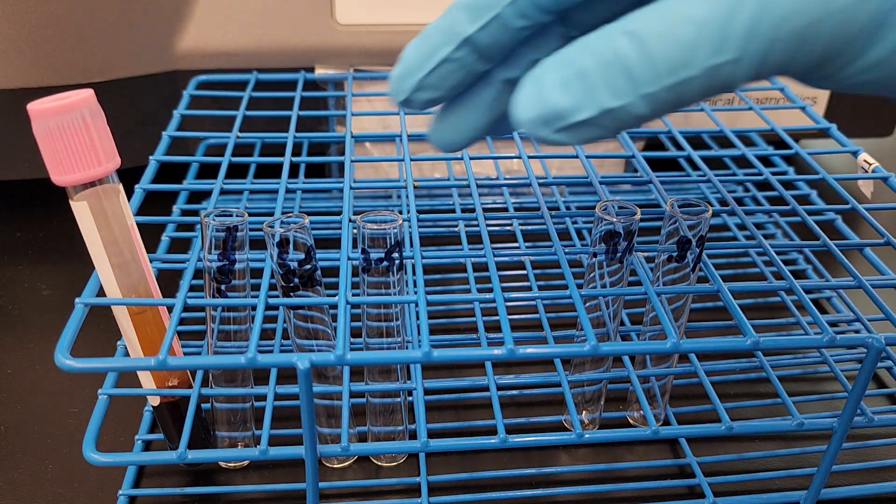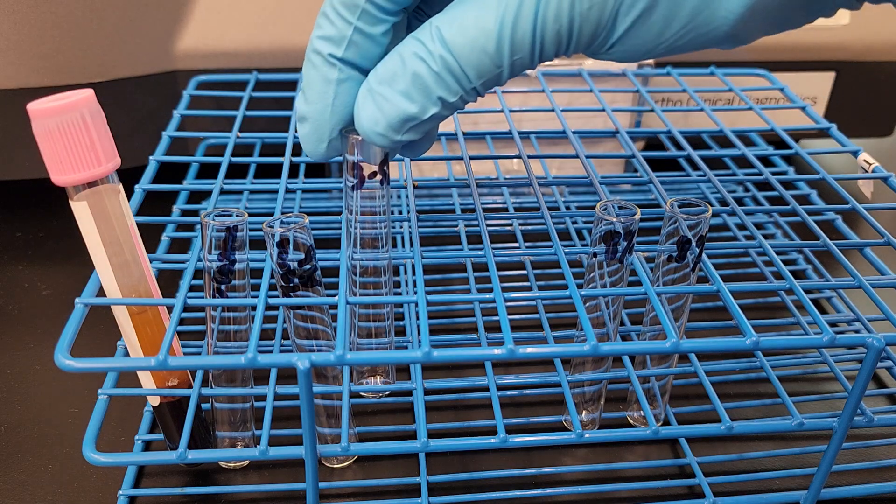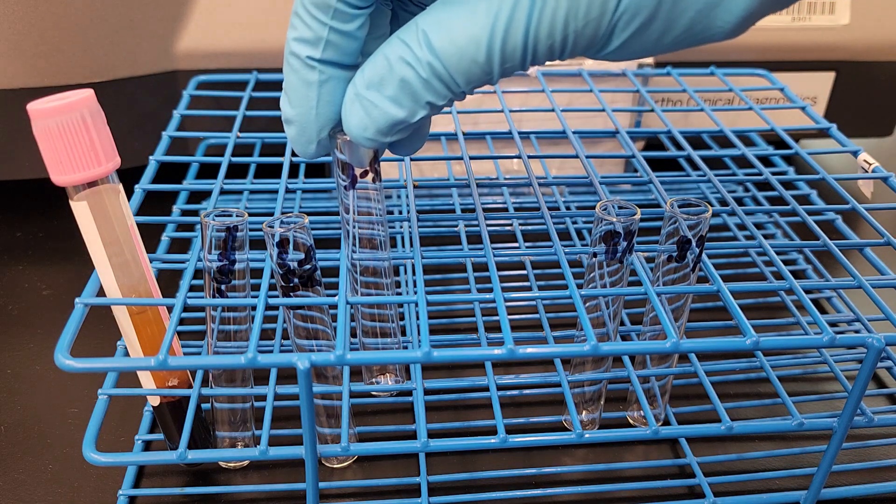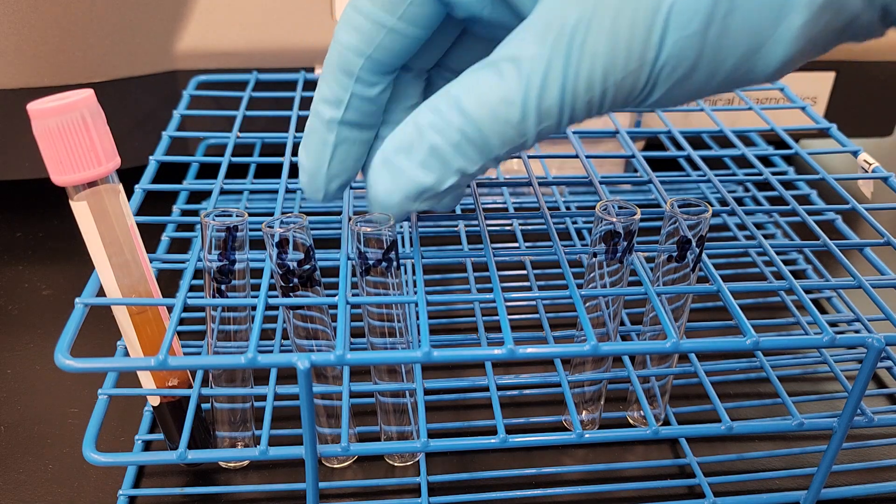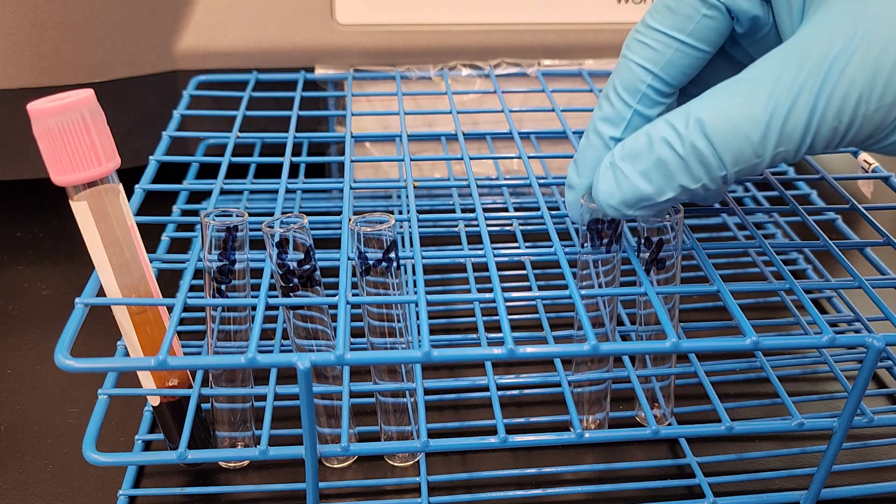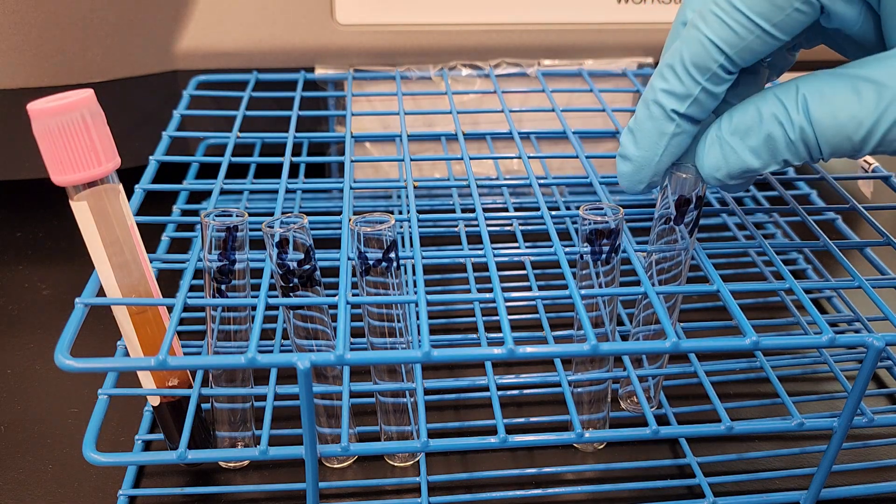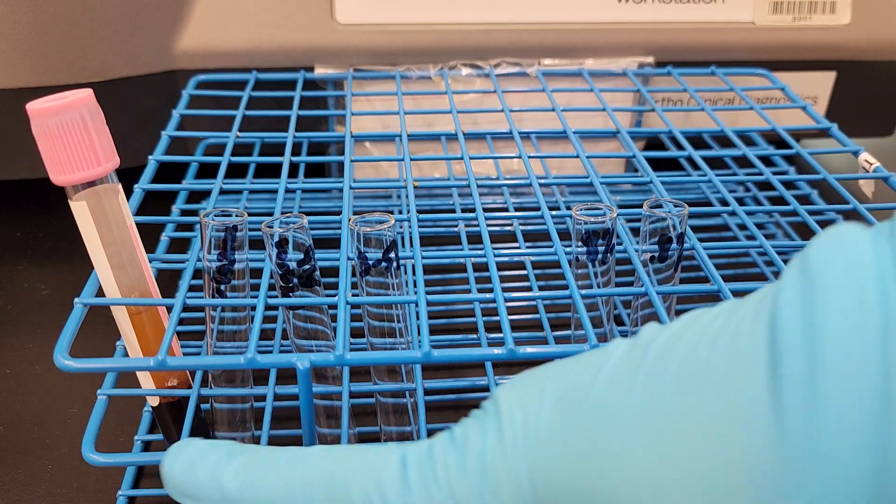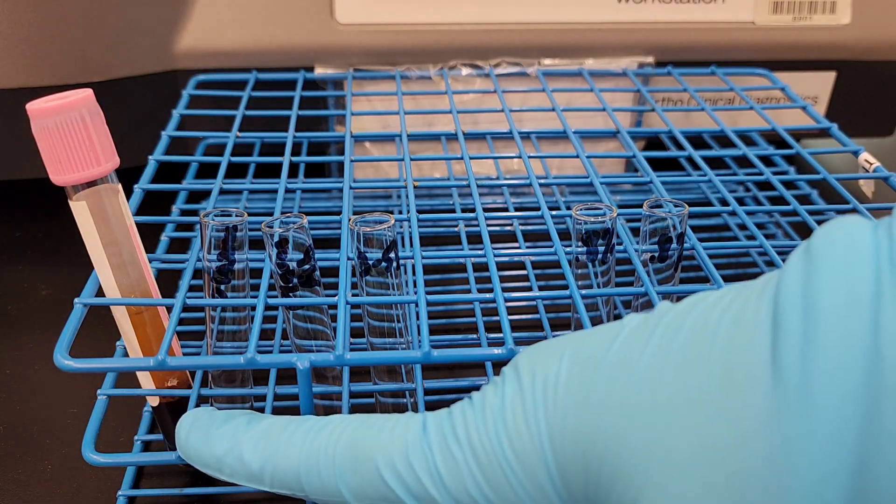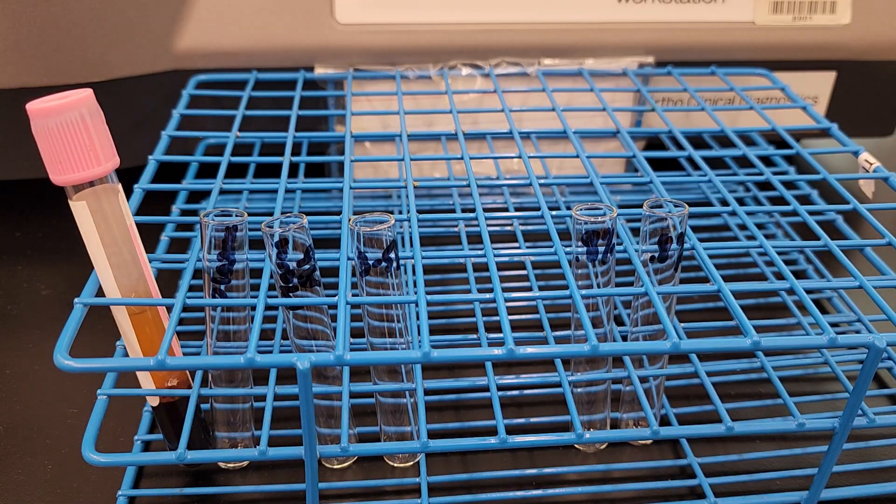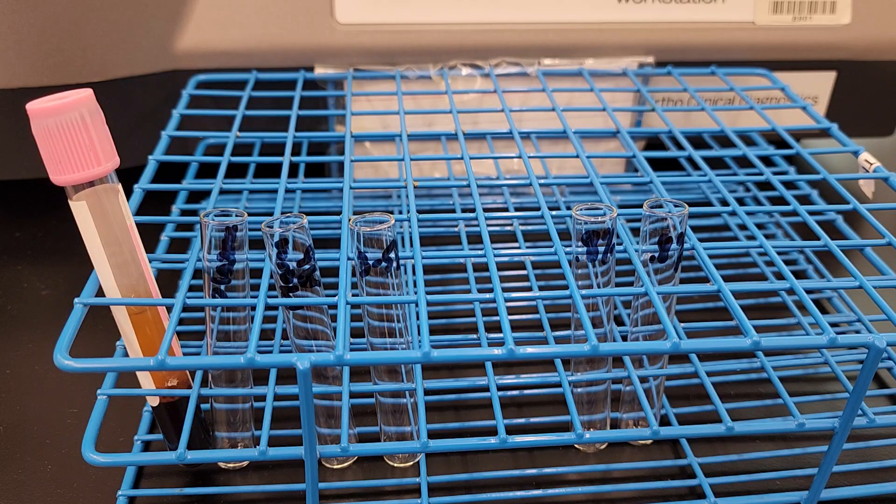So we're going to learn how to make it from a 3 to 5% red cell suspension that you would use with the tube method into a 0.8%. But we're also going to learn how to do a 0.8% immediately from the packed red cells in your spun EDTA tube. So let's go ahead and get started.